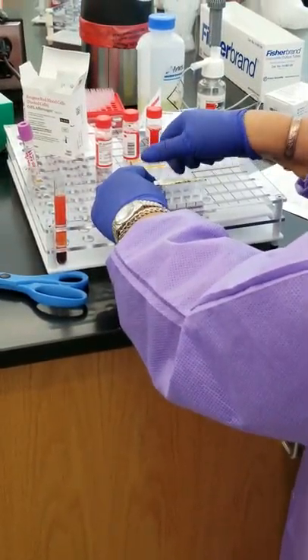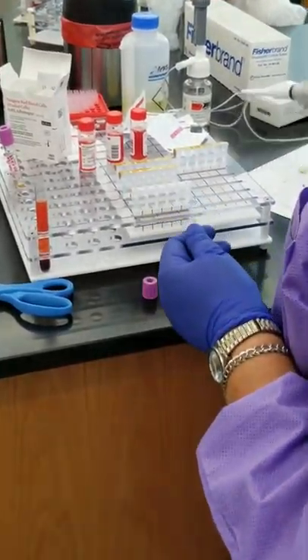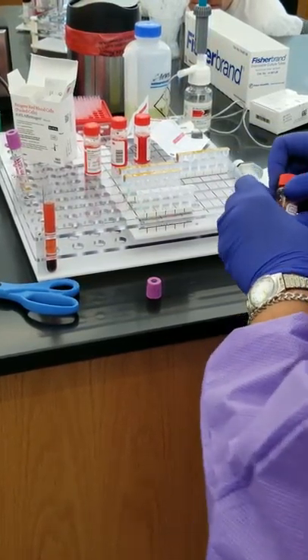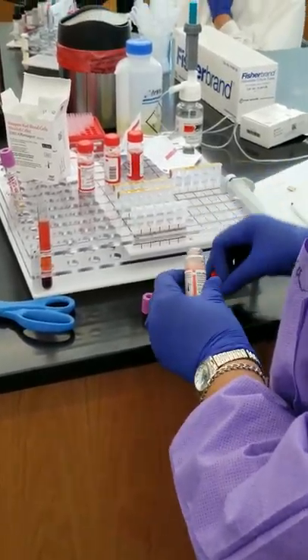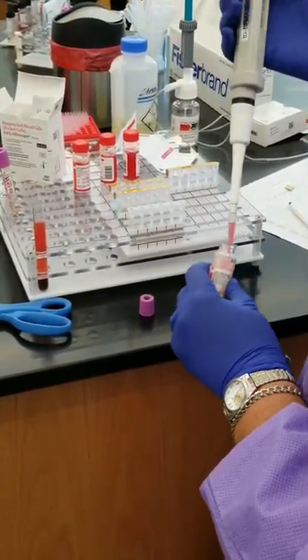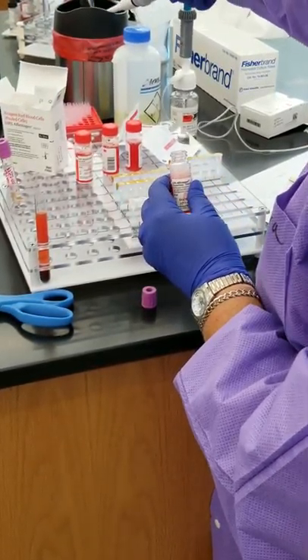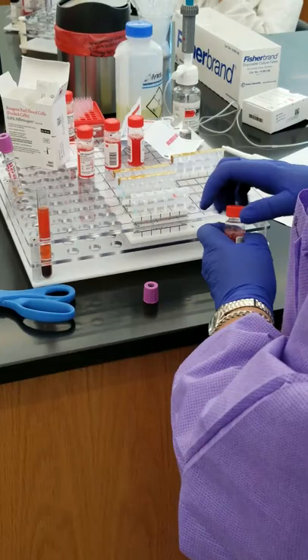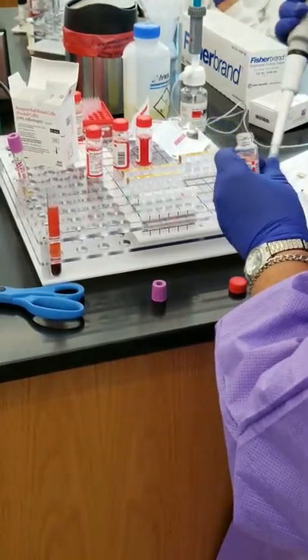I'm going to go ahead and open this because this is only good for one patient. So in keeping with our usual, we're going to go back to 50 microliters. And I have all this written down for you guys, so I don't have to take too many copious notes. All right, so I'm going to put A1 cells in the first blank well, and that's 50 microliters. And I'm going to put 50 microliters of the B cells in the second one.